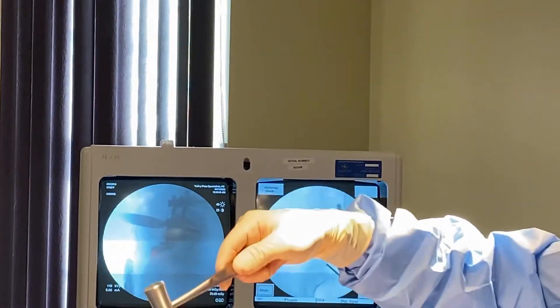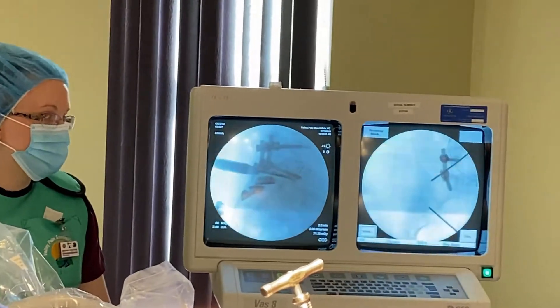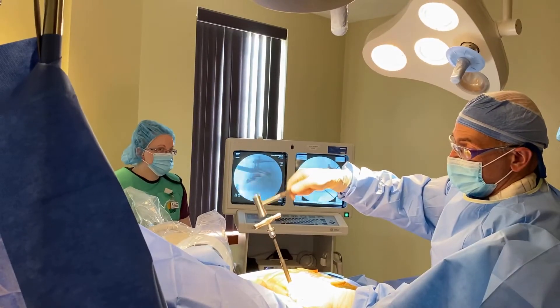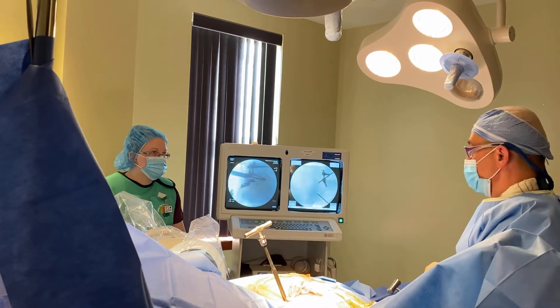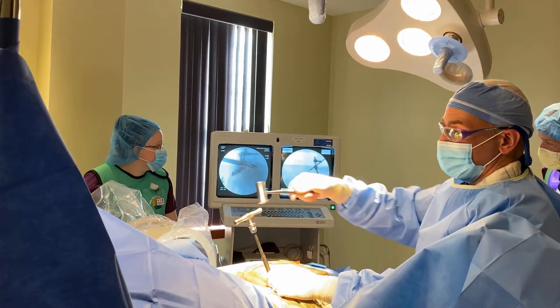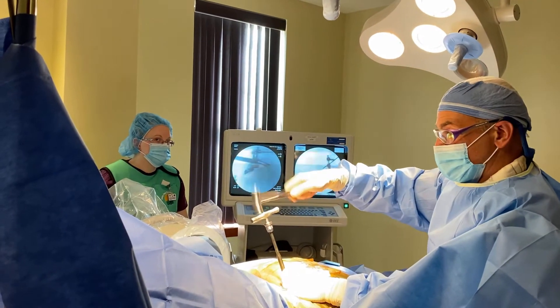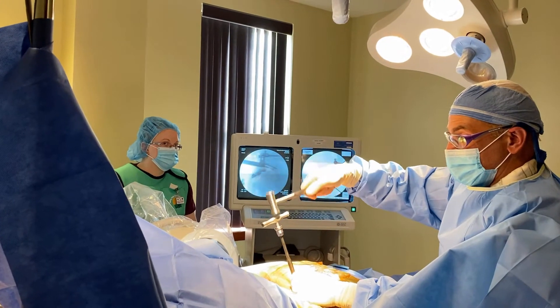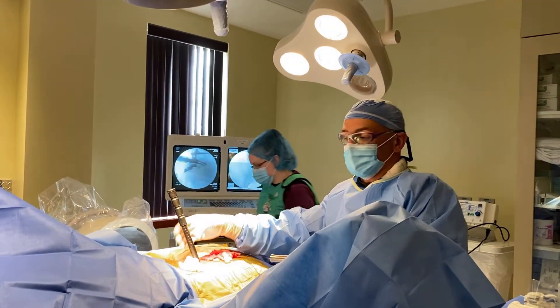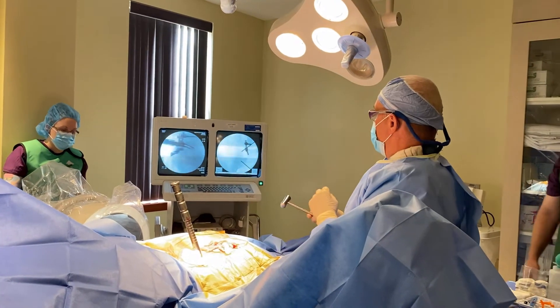We advance it until it hits a hard stop on the sacrum — it's going in perfectly. The patient will feel a little bit of pressure. We've numbed up the area very well. Now we've placed the working cannula as well as the mallet device over the top, and we're going to tap it in over the joint finder using fluoroscopy to determine the depth.